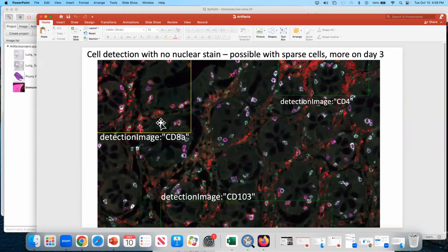This is immune colon. There's staining for CD8, CD4, and CD103. CD4 is expressed on many more cells. There's also macrophages express CD4 because they're annoying and beautiful. And on the other hand, CD8 cells have this more stereotypical way of being more spread in the tissue. CD103 cells, similarly, are a little bit more spread. So if your cells are far apart and they're not clustered together too much, you can essentially just use CD8 instead of hematoxylin or DNA as your detection image, and the same for CD103 and CD4.